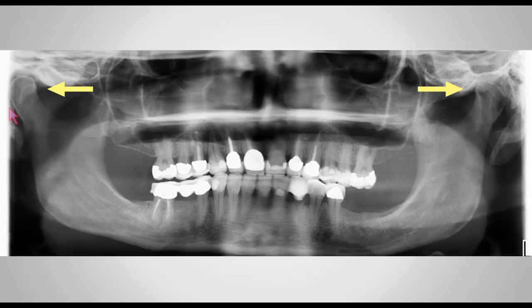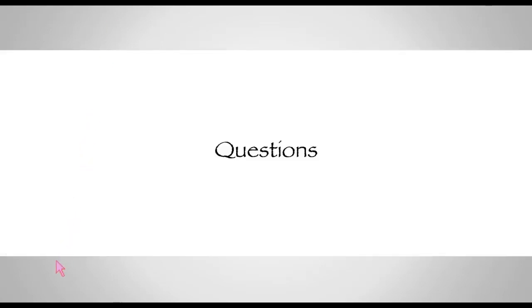So this prototype served its purpose, not only to improve the aesthetics and to show me the functionality of my plan, but most importantly, in this particular case, it served as an orthopedic appliance, making sure that I was able to stabilize the occlusion by stabilizing the starting point of full mouth rehabilitation dentistry, which is the position of the condyle in the glenoid fossa. And if I'm not mistaken, that is my last slide.